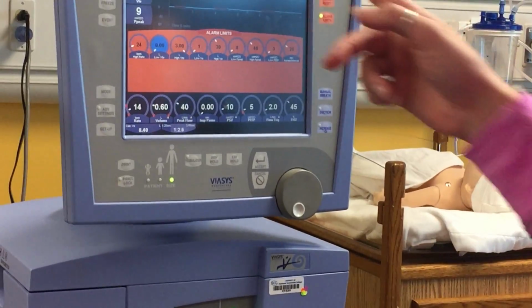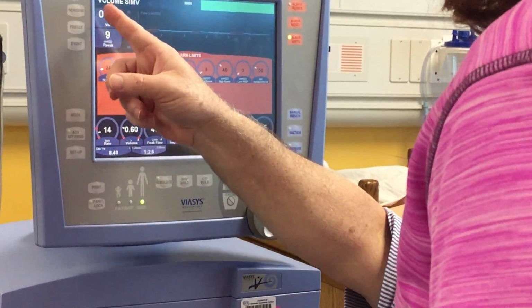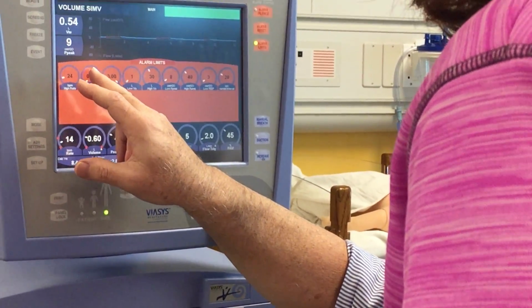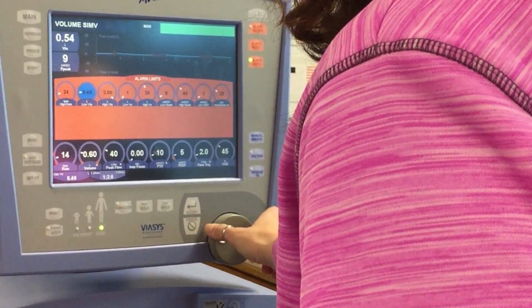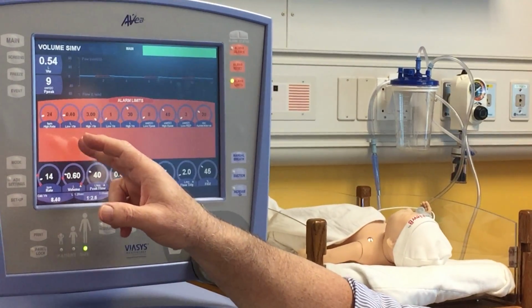440. So you go 100, 100 down, under that. That's why we pulled it up. So go ahead and set your low VTE. Now, yeah, because it's in liters. Okay, now, so that's our low.